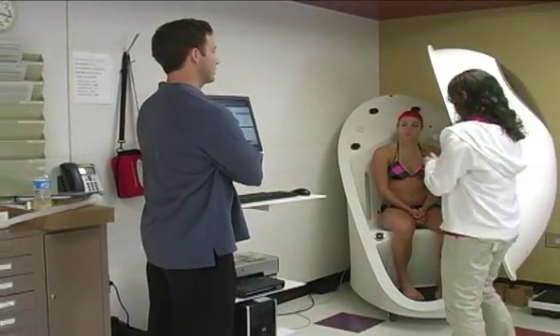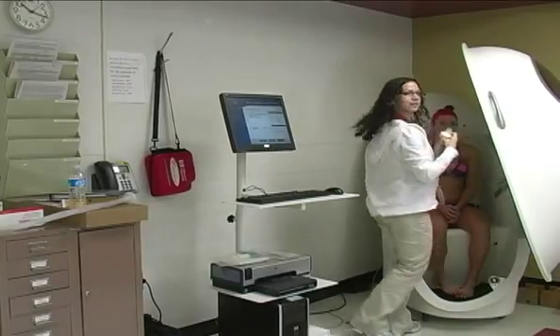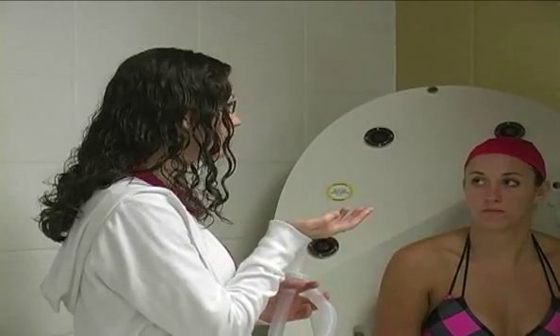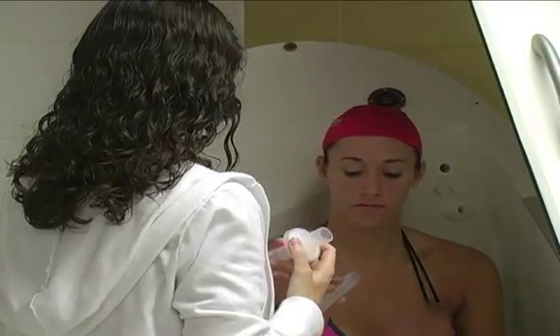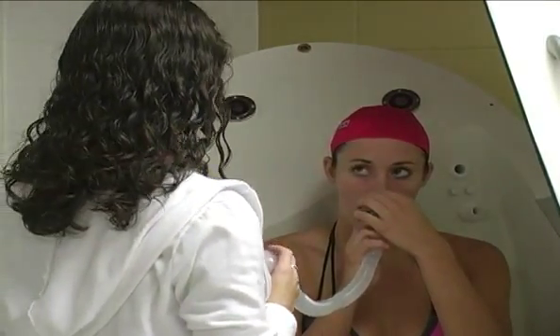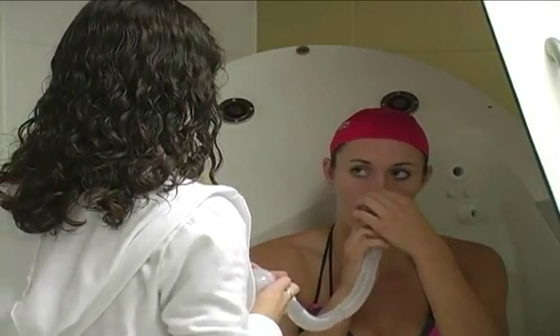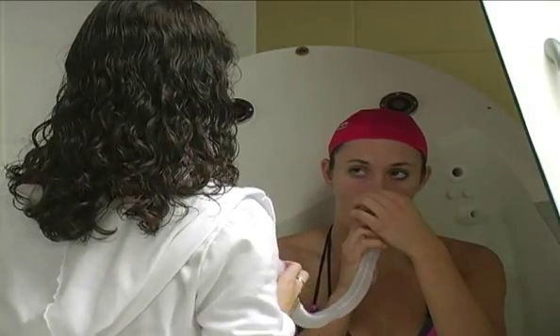This is where we'll do the rest of the test. So I would take out the ready and just kind of go through. So we're first going to have you put this, after you sit in here for a little bit, you're going to be prompted to huff 3 times, and it's going to be very gentle and light. In your mouth, you're going to try and breathe. It's going to say in and out, so try and breathe like that, following what's on the computer screen, and then it's going to tell you to get ready to huff. Then it's going to ask you to huff 3 times, and you're going to huff like you're trying to move a feather, so very, very lightly.